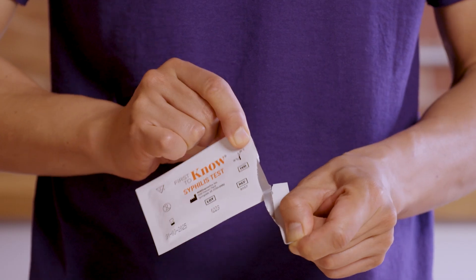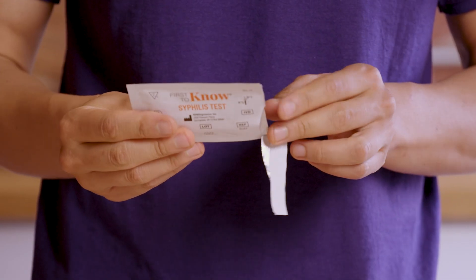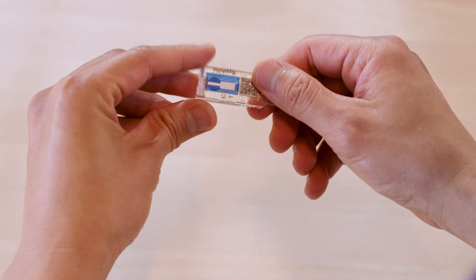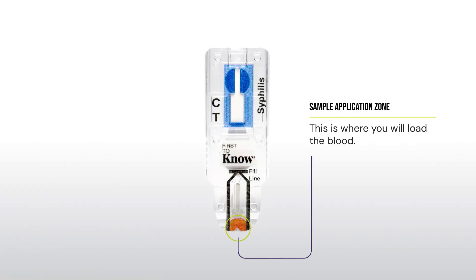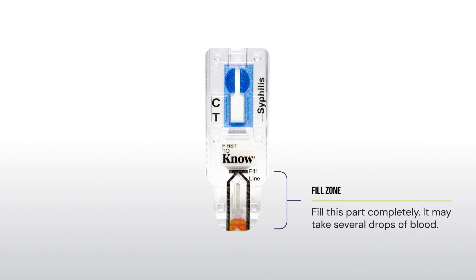When you are ready to begin, tear open the test pouch at the notch. Place the test cassette on a flat surface. Let's get familiar with the test and locate the sample application zone. This is where you will load the blood sample into the test. This is the fill zone. It is important to fill this part of the test completely. It may take several drops of blood.